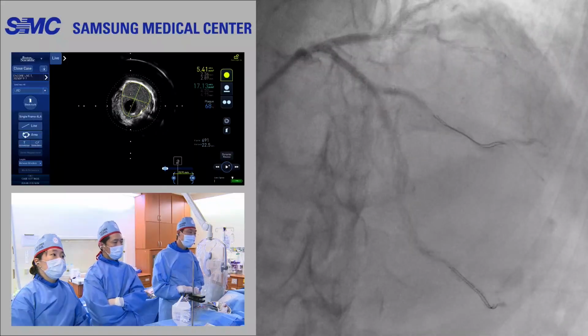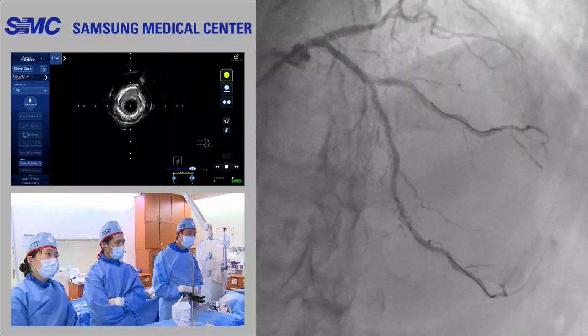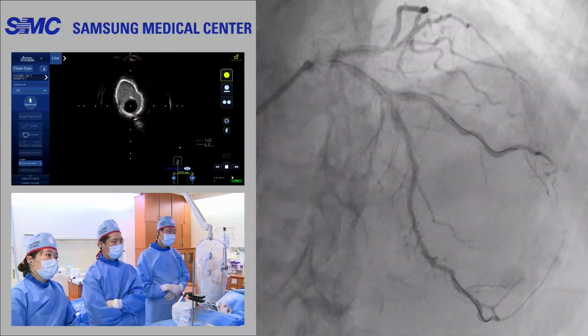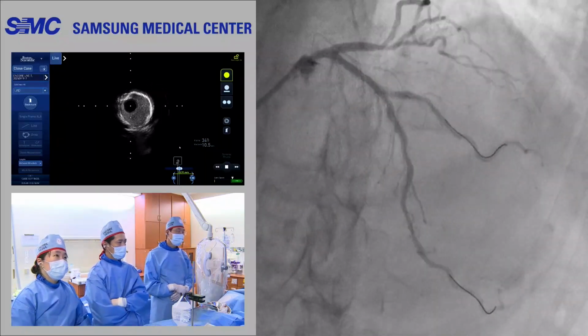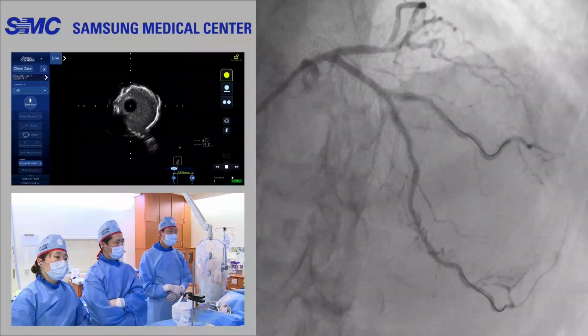Thus, I think it is a very optimal balancing point to meet efficacy and safety. And the diagonal os is a very hard region. Even though it is well expanded by balloon, there is sudden recoil, so just leave it alone. The problem is this patient has HBR, very old age, and a bifurcation lesion just treated with DB.